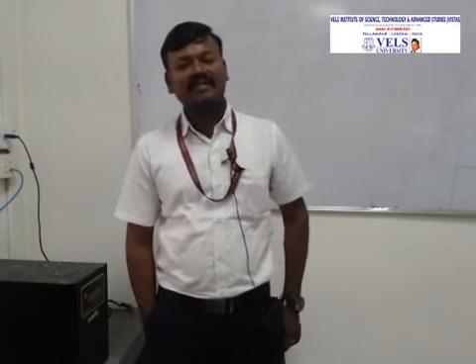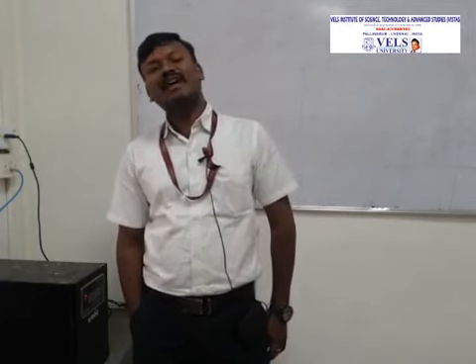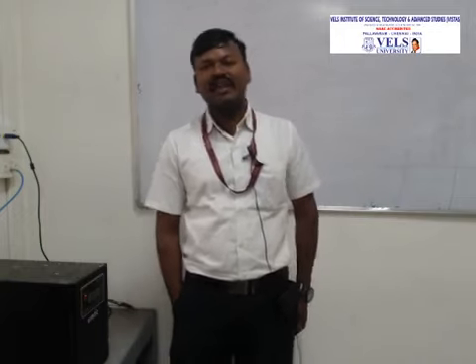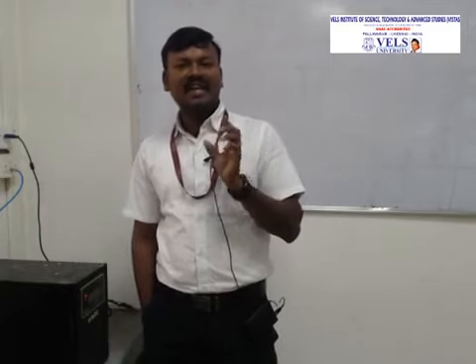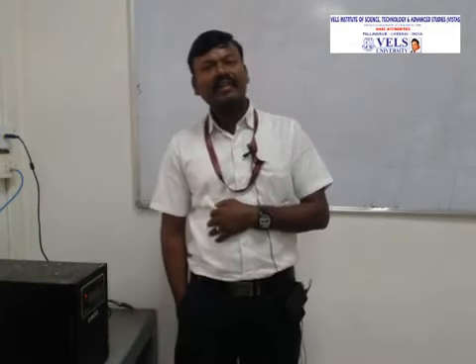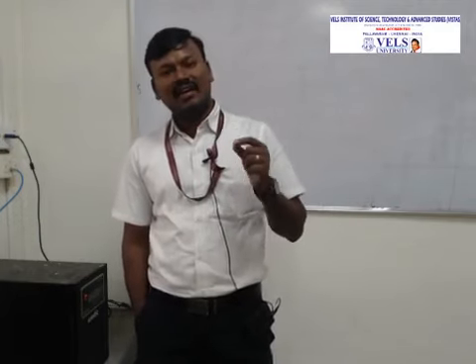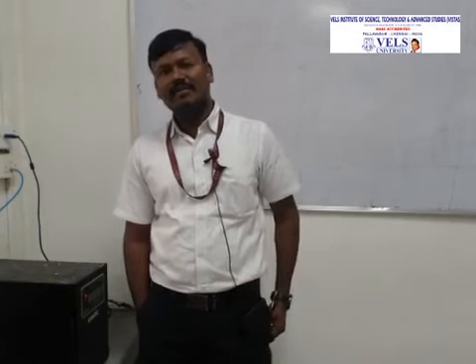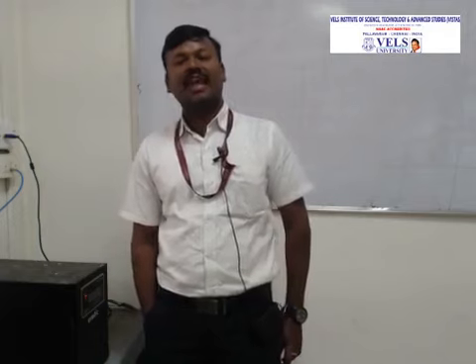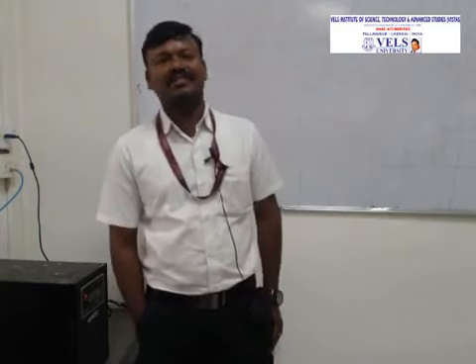These are the important factors to be considered for micromanipulation. Now we will discuss the method for PGD. First, we isolate a single cell from the 6 to 8 cell embryo, using a fine glass needle to puncture the zona pellucida. What do we mean by zona pellucida? It is the layer mediating communication between the follicle cells and the sperm cells, which helps in fertilization.